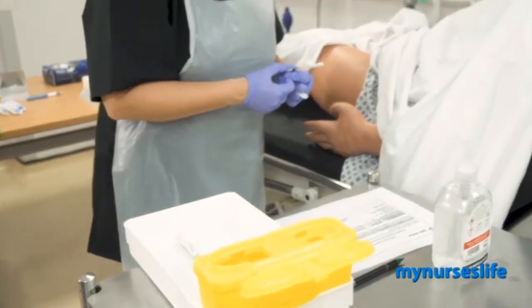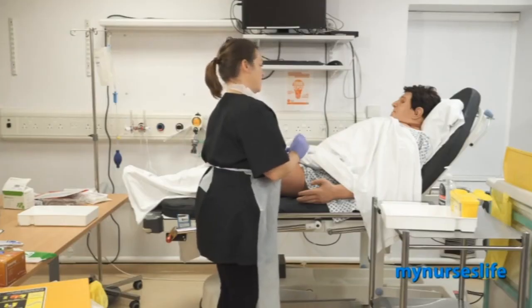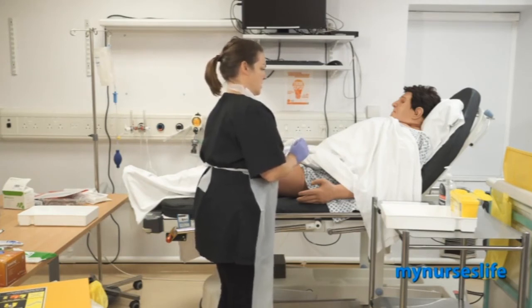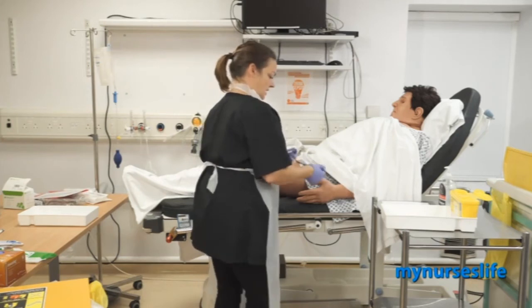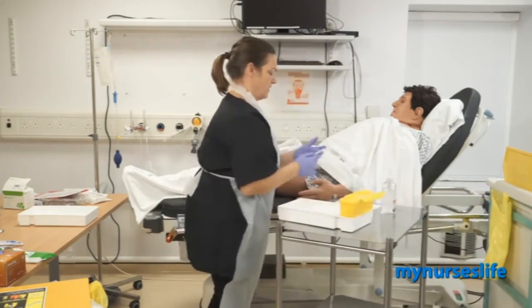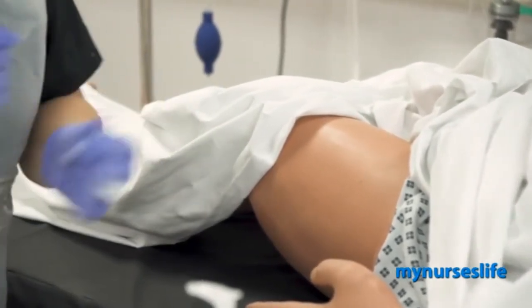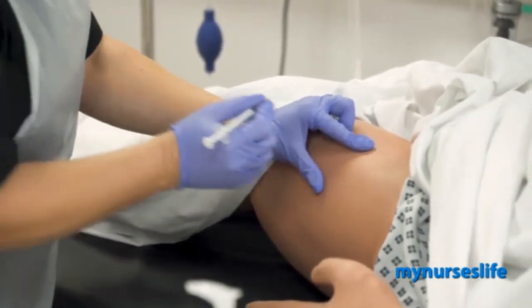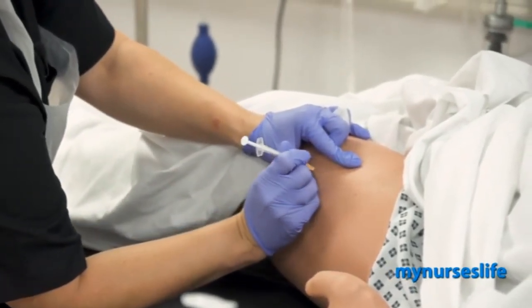So this is, as I say, a subcut injection. It goes under your skin. It's not a very big needle, so it shouldn't hurt too much. So if you take a deep breath, though, when I give you this, I would actually move my tray a little bit nearer. So I'm just going to give you this injection now, Emma, okay? Because it's subcut, I'm actually going to pinch the skin this time to lift off the muscle. Ready, Emma? It's coming now.